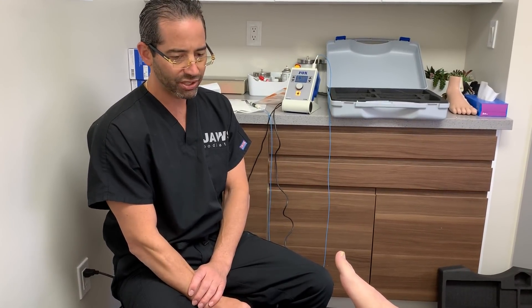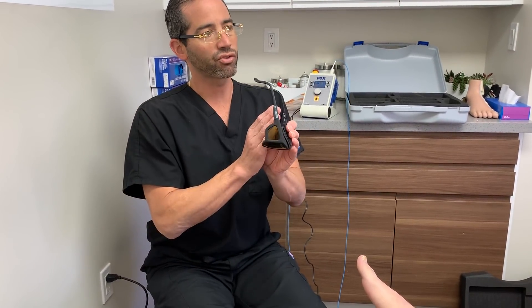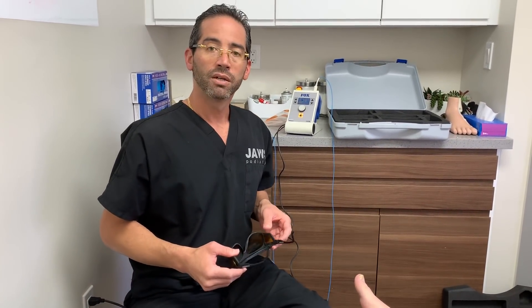We have a young gentleman here. This is actually the same gentleman that we just did the other procedure on. I'm deciding to separate both videos on purpose so I can put this one out, and the other video will also be posted as well. Very briefly, in the toolbox for fungus, we have it all here at JAWS Podiatry.